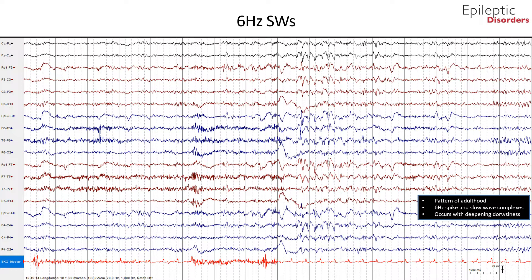The remainder show a history of syncopal attacks, post-traumatic states, or psychiatric problems. The 6 Hz spike-wave complex is an uncommon but not rare pattern. The discharge may be recorded in the waking state, drowsiness, and light non-REM sleep. Light drowsiness appears to be the optimal recording condition. There is a particular emphasis on the distinction between frontal and occipital maximum.